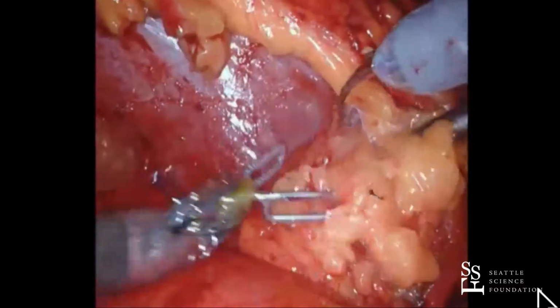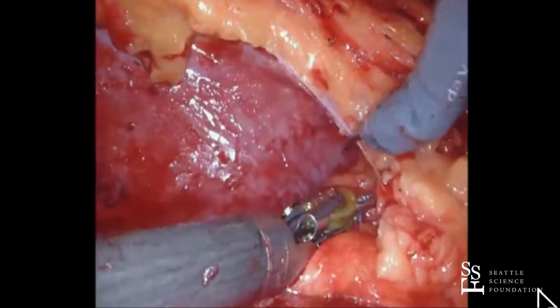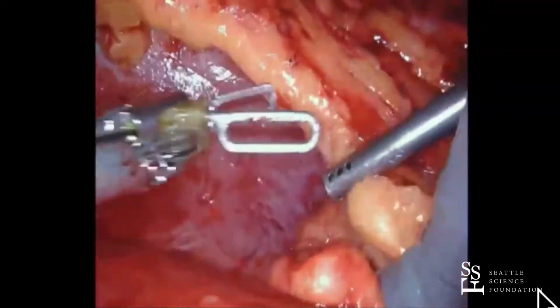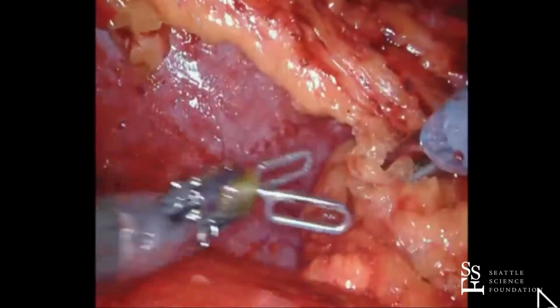Yeah, I think that's a great point. I think you can do that in any case, trans, retro, if you're not sure where you are, ultrasound is really nice. Of course, you have to know what you're looking at, so there is a learning curve with ultrasound. We don't talk much about it, but you have to become used to looking at things.